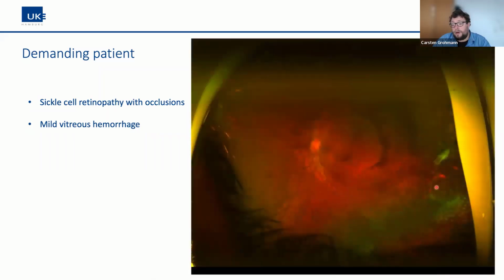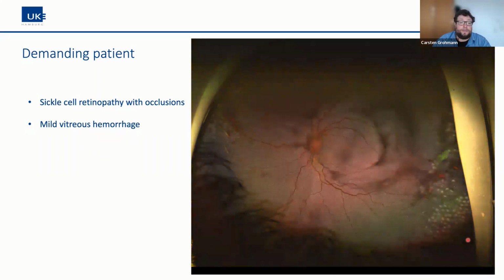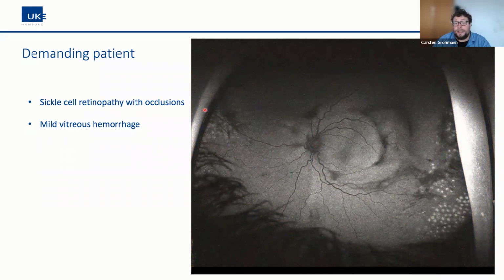Good outcome of the laser spots. So also, due to the mild vitreous hemorrhage, I'm very happy with this result. I can see it here on the autofluorescence.